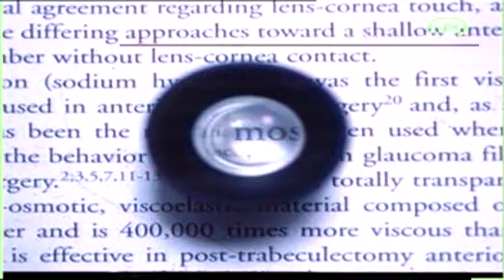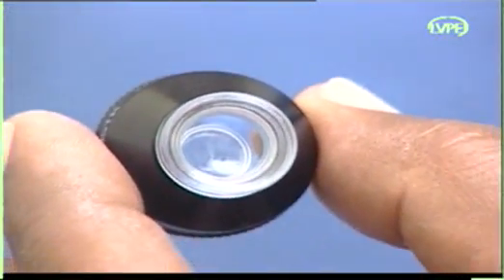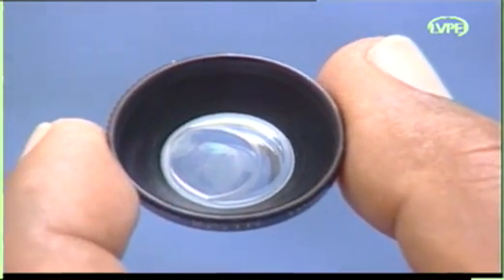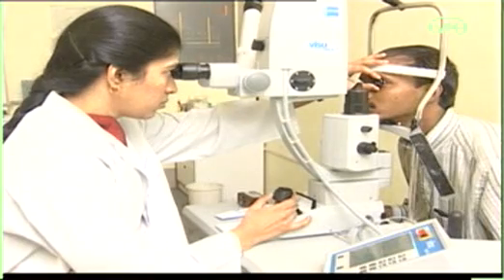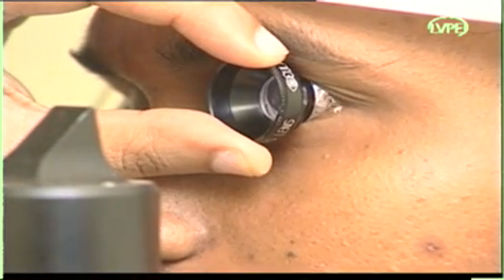An Abraham iridotomy lens is used during the procedure. It consists of a corneal contact lens with a plus 66 diopter plano-convex lens button placed on its anterior surface. This lens improves visualization, ensures lid separation, stabilizes the eye, minimizes epithelial burns acting as a heat sink, and increases the power density by concentrating the energy into a smaller spot size at the iris.